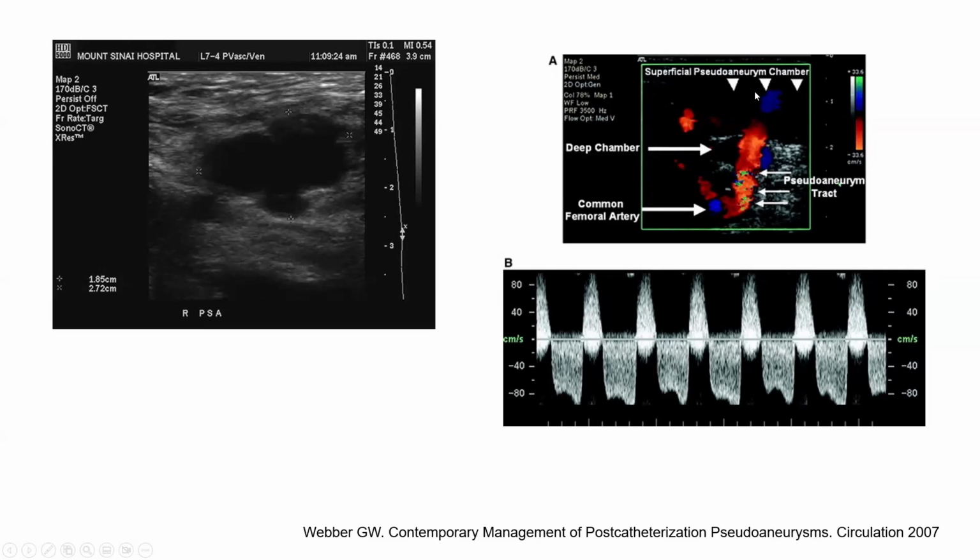which will be here. It will be a vein, basically. You will be injecting it with thrombin. And some patients have both because both are associated with a low stick. So they may have pseudoaneurysm and AV fistula. And you have to make sure there is no AV fistula before you inject thrombin.